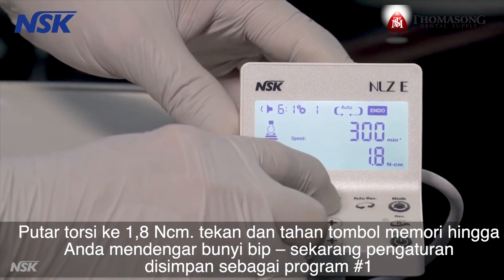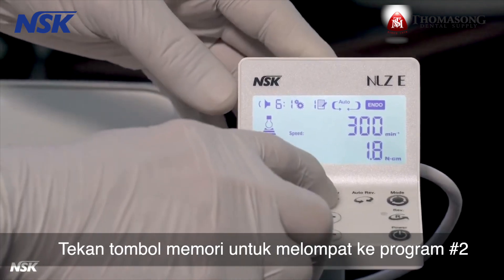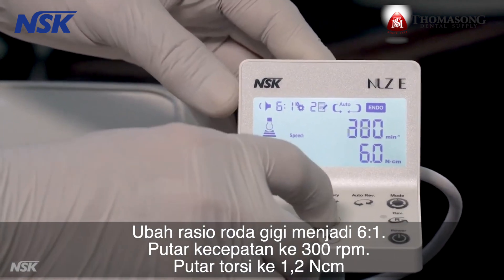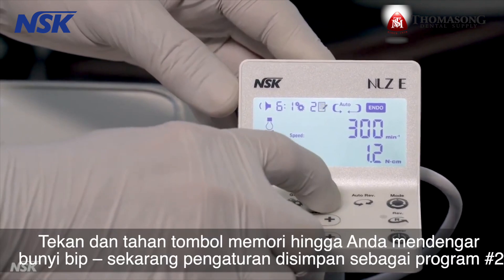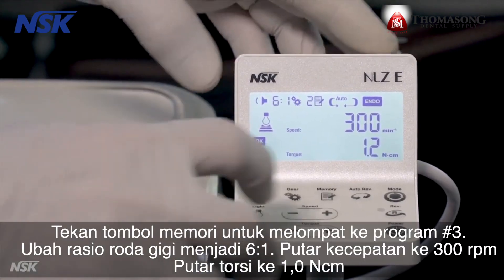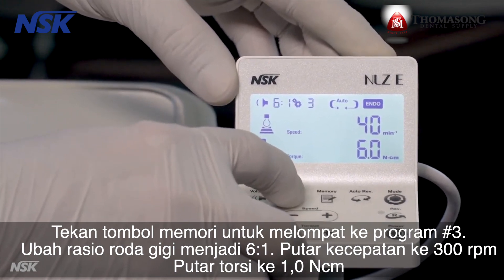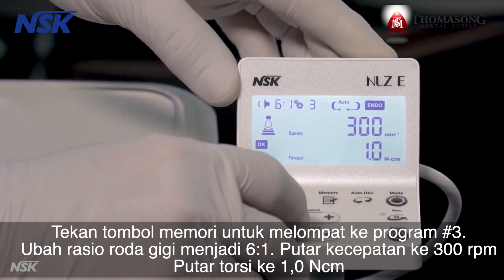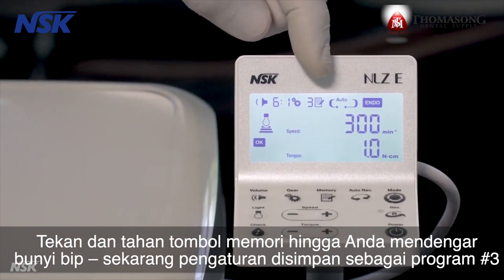Press and hold the memory button until you hear a beep — the setting is stored as program number one. Press the memory button to jump to program number two. Change the gear ratio to six to one, dial the speed to 300 RPM, and dial the torque to 1.2 newton centimeters. Press and hold the memory button until you hear a beep — the setting is stored as program number two. Press the memory button to jump to program number three. Change the gear ratio to six to one, dial the speed to 300 RPM, and dial the torque to 1.0 newton centimeters. Press and hold the memory button until you hear a beep — the setting is stored as program number three.